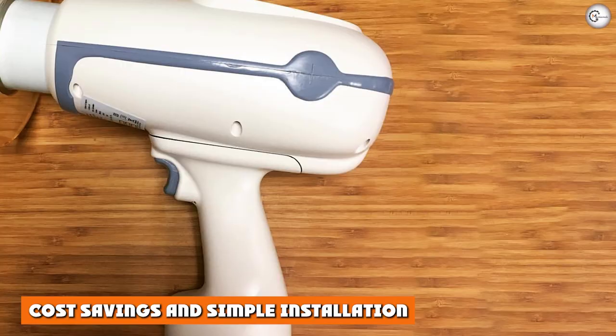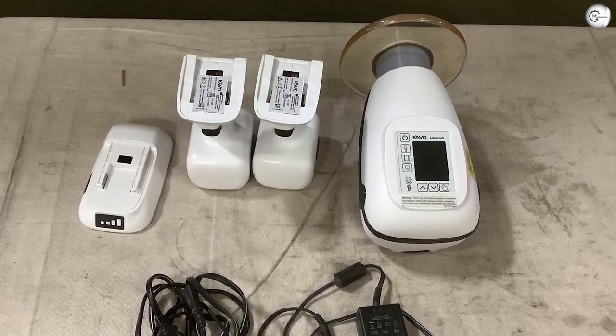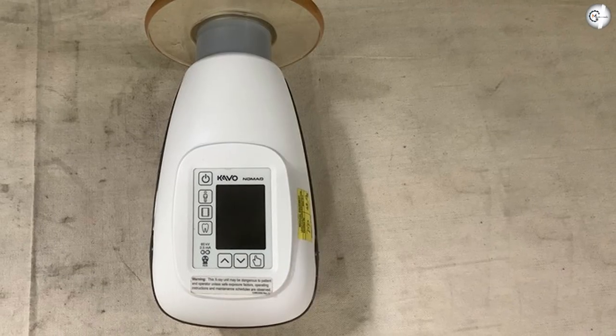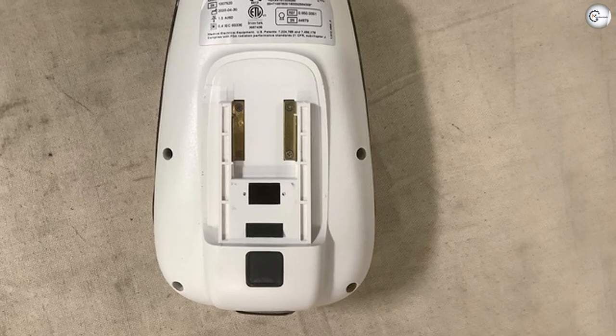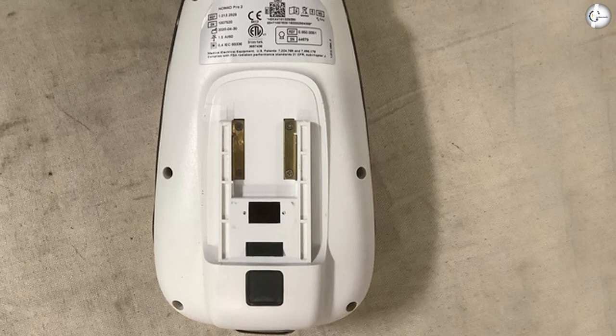Cost savings and simple installation. With the Nomad Pro 2, there's an immediate cost savings over multiple operatories that would need wall mount units. With your new handheld system, you can save on the cost and time of special construction, wiring, and installation. Safety literature and training videos are provided, and your Nomad Pro 2 is ready for use right out of the box.